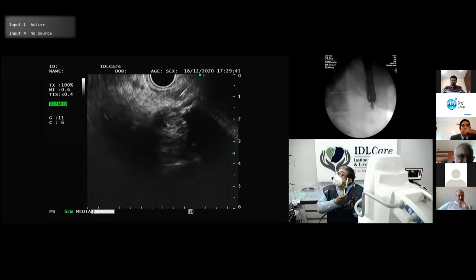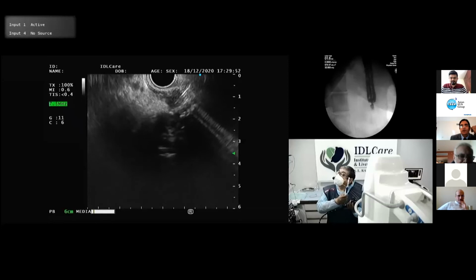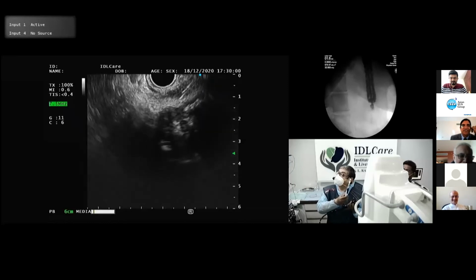But to puncture the wall, you see it is denting the wall. You can see? It is denting the duct wall. See inside that? So one more big push, one last push. Yogesh, after that I'll give up. Okay. I don't want to trouble her.